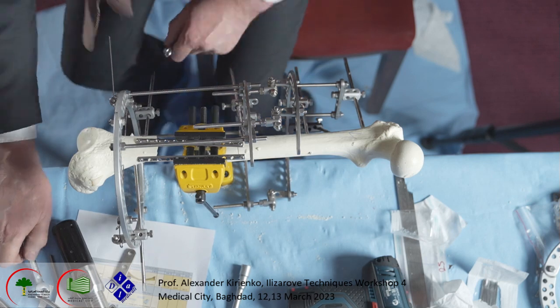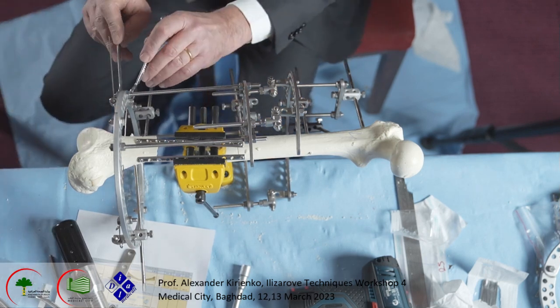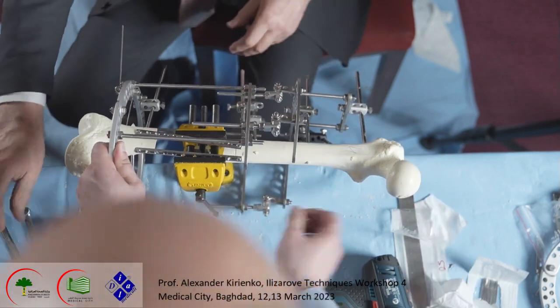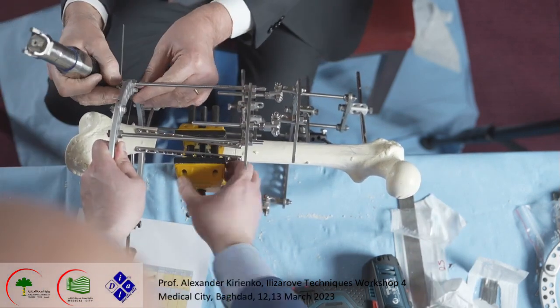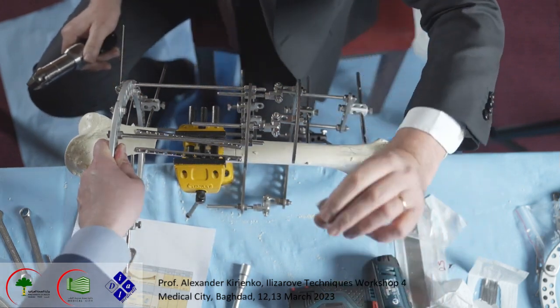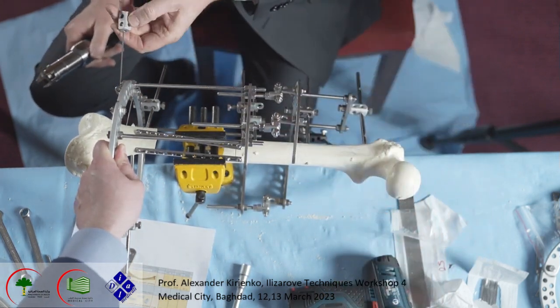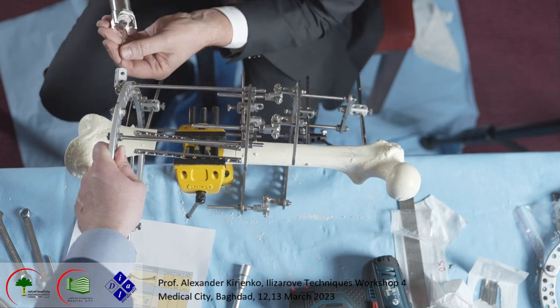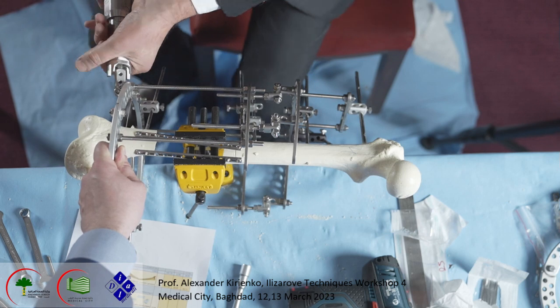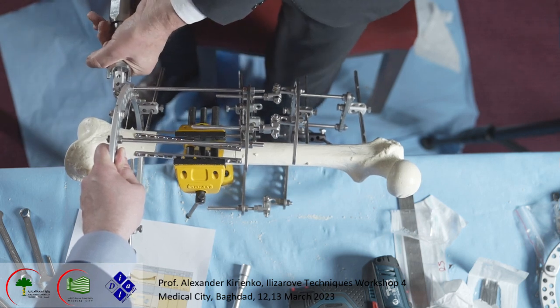Okay, and now here we may do the tension. To achieve tension with the tensioner here, not so comfortable, we may use this post on the side here. Keep the cube like this. Okay.